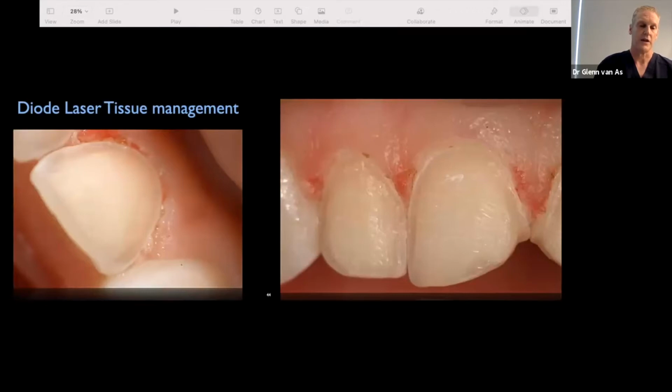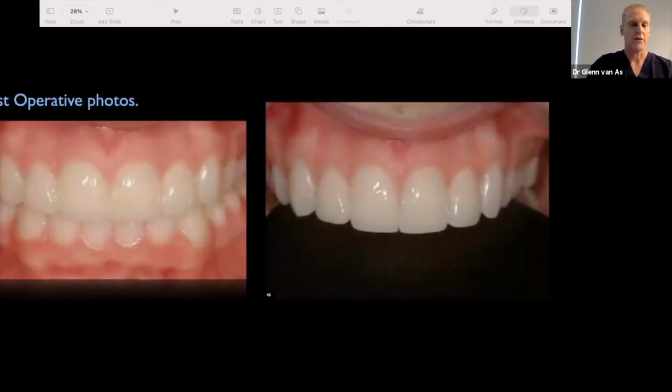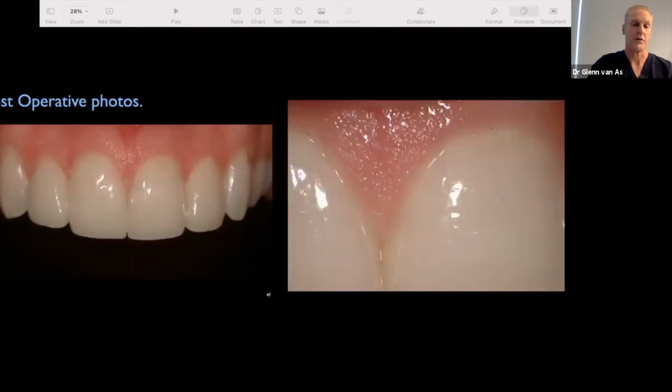Often we'll use a product like Expasyl or one of these agents like Traxodent to try and help push the tissue back in some cases if it's very deep. Here we did that in the old-fashioned case and got a very nice impression, put our provisionals on. And here we are with the post-operative result, which I think is a nice result. The tissue health looks fantastic. You can see interproximally the stippling that's occurred. And it's hard to differentiate the margins in this case from where the tooth begins and where the margin is.